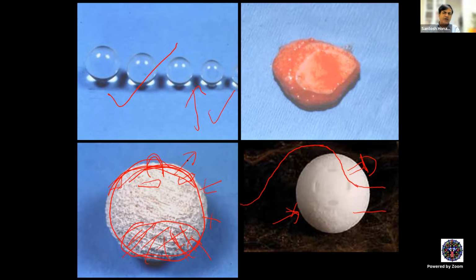Now, to avoid using sclera, because sclera is not readily available, the implants come with their own coated material like that. The anterior surface of the implant is coated with something that lasts for a long time. The posterior surface is also coated with something that lasts for a shorter time. Why should the posterior surface be coated at all?